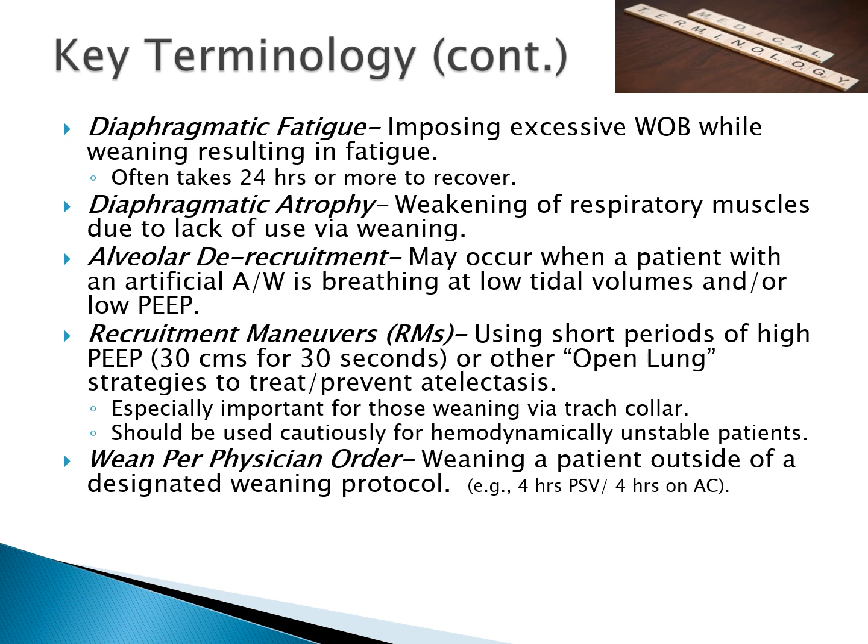Wean per physician order, so weaning a patient outside of your hospital's weaning protocol. It may be like 4 hours on pressure support, 4 hours on assist control, something along those lines. The evidence to support a 4 and 4 is not that strong, but anecdotally, some places seem to be using it with some success.